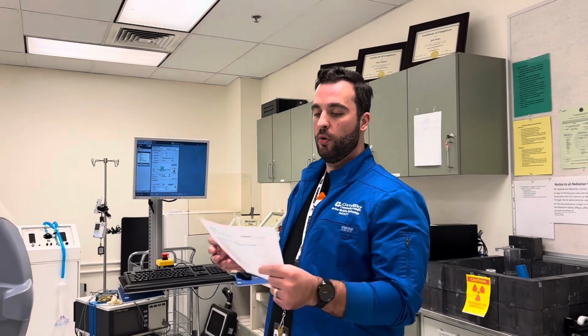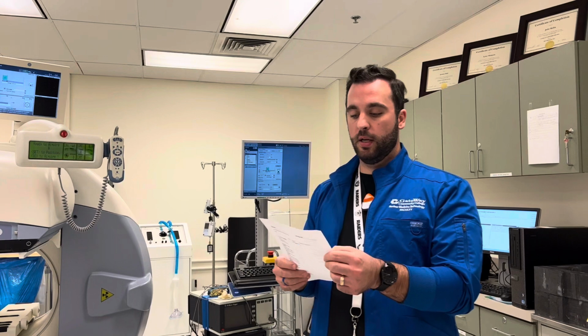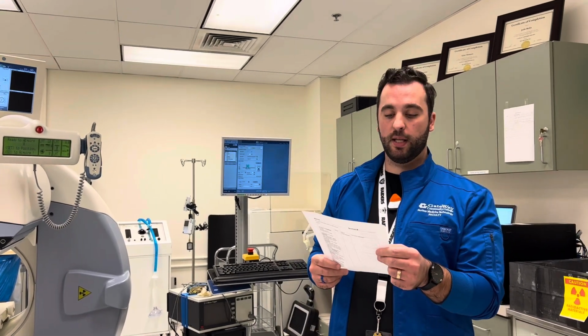Okay, so I'm going to show you two different protocols. The first one we're going to do is a whole body bone scan. We're going to start on the determination of protocol on your rubric. So this patient is a male with prostate cancer, so we're going to do a whole body for prostate cancer.